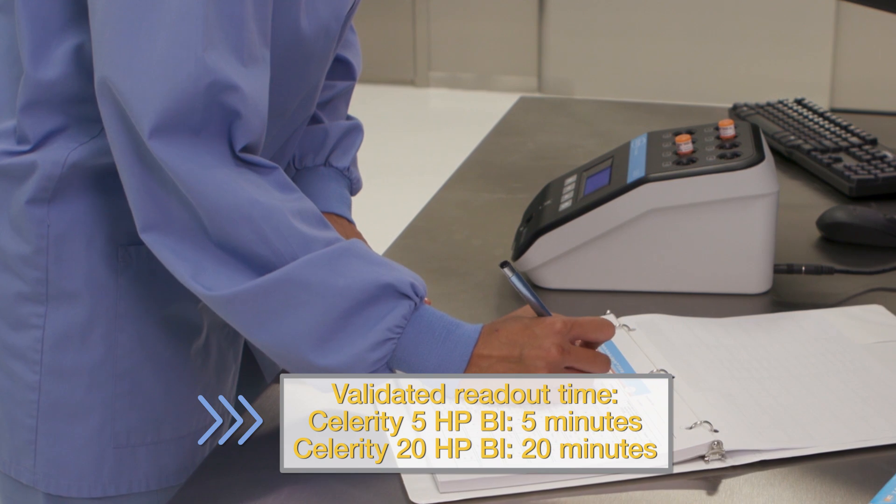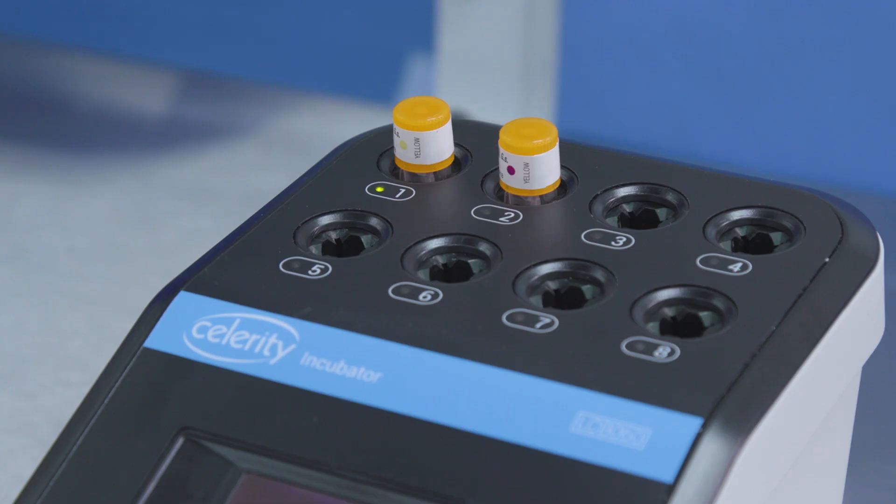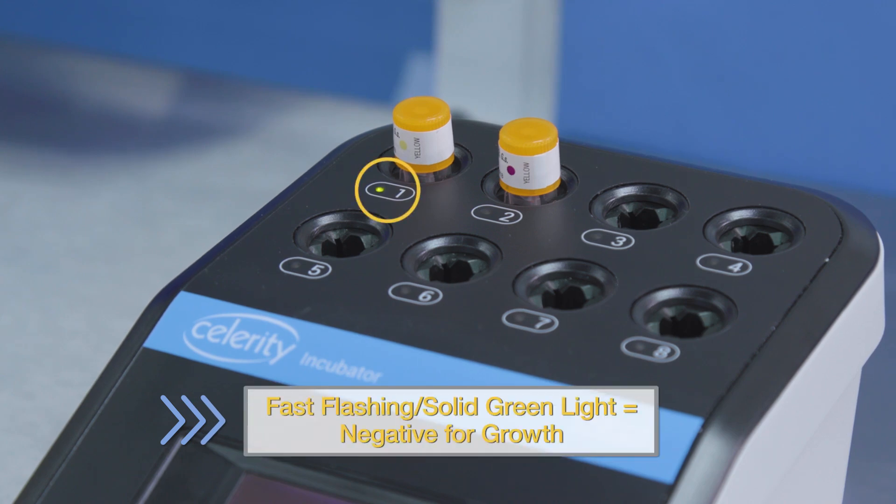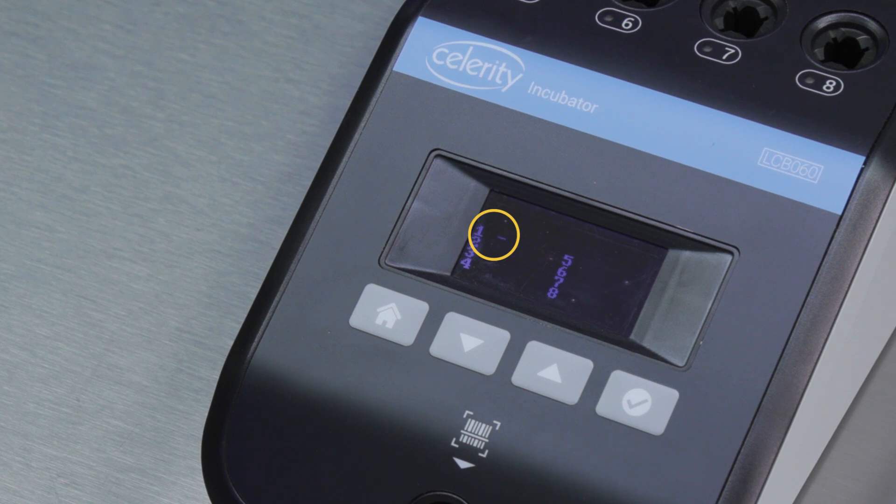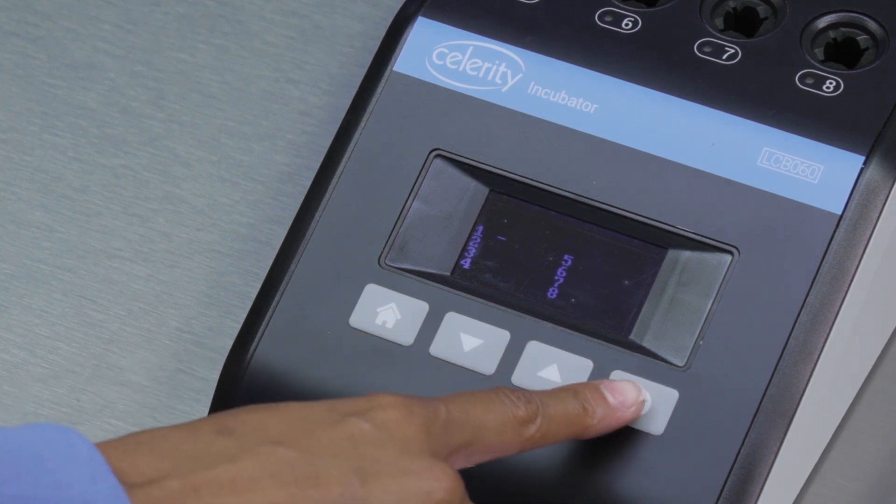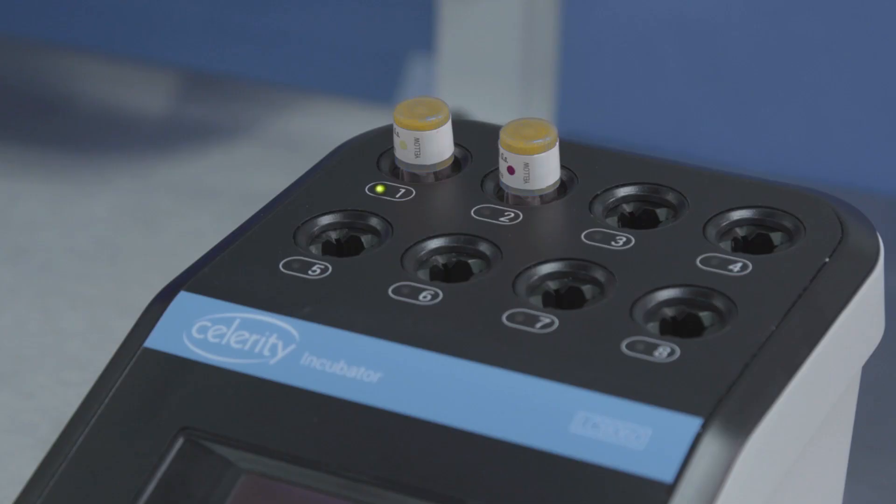Read and record the test and control BI results within the validated readout time. The BI is negative for growth when the incubator demonstrates a fast flashing green light, an optional audible alarm, and a minus sign on the screen next to the corresponding well number. Acknowledging the result will silence the alarm if buzzer mode is on, and the LED will turn solid green.